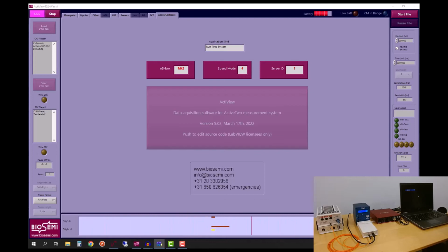The one in the middle, the longer code, is actually the trigger output code that's being generated by Triggy for the sound coming in. So you have these 3 bits. You'll need to pay attention to the ones that are important to you, of course. If you weren't using the serial port, you would have just the one long pin raised in the middle.